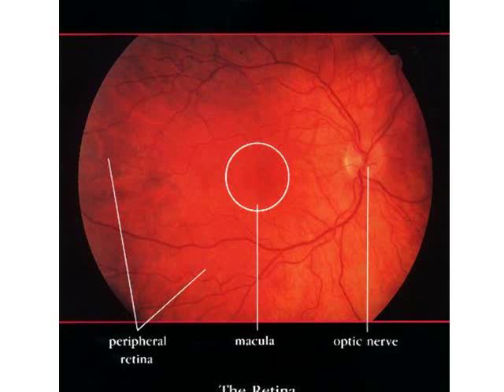This is a normal retina. Here you see the peripheral retina, macula, and the optic nerve.